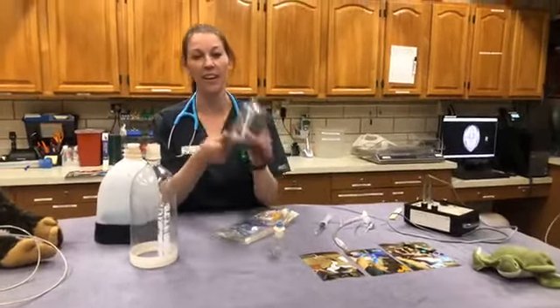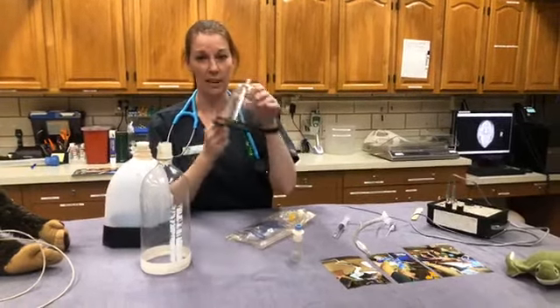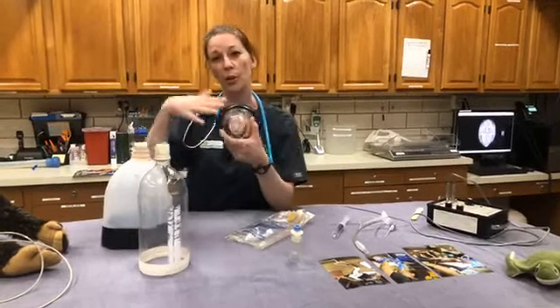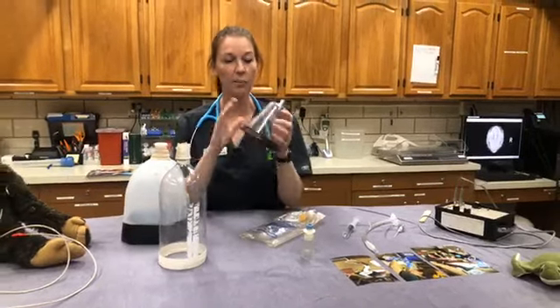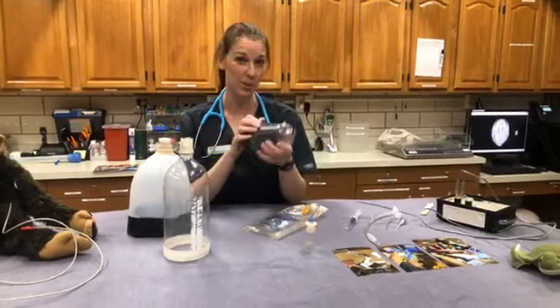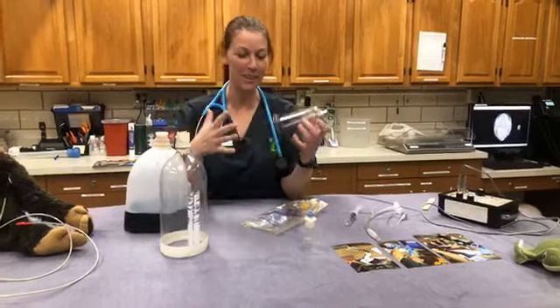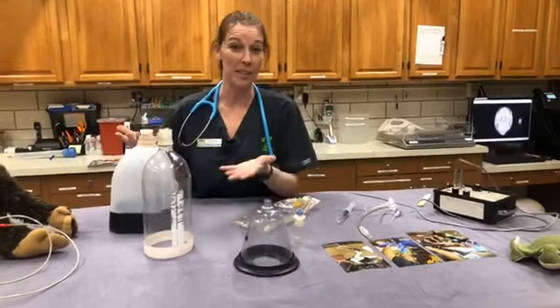So I'm going to say cat and dog clinic a lot, but it's just how we compare everything. So in a vet clinic, like a small animal practice, this would be a normal face mask for anesthesia. So this just goes over the face, and then you can blow the oxygen and the gas so that they'll go to sleep. And so they don't make these for tigers or storks or tiny birds or like weird face-shaped animals. So sometimes we have to make up our own, and we get to repurpose items.